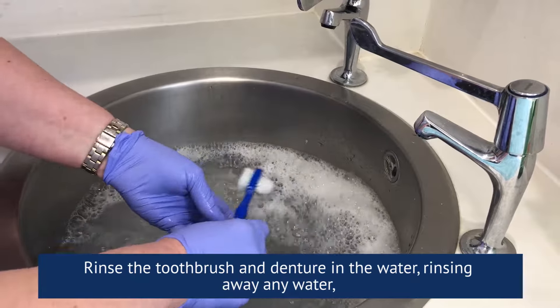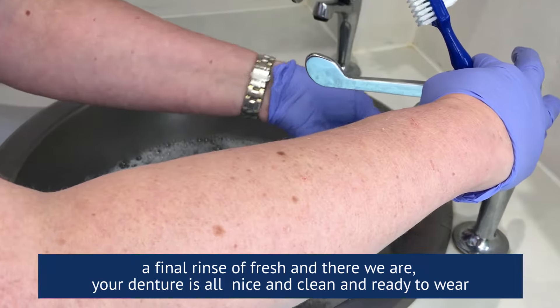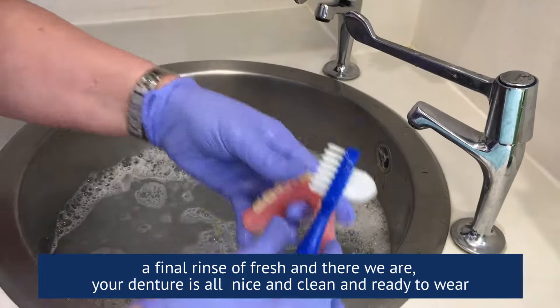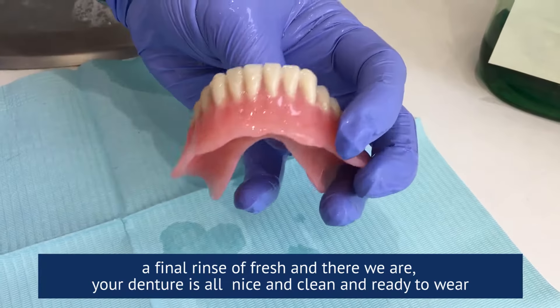Rinse the toothbrush and the denture in the water, rinsing away any soap. A final rinse of fresh water and there we are — your dentures are all nice and clean and ready to wear.